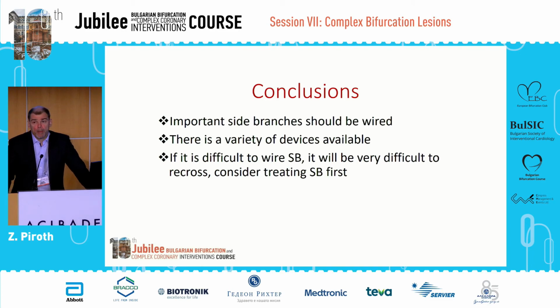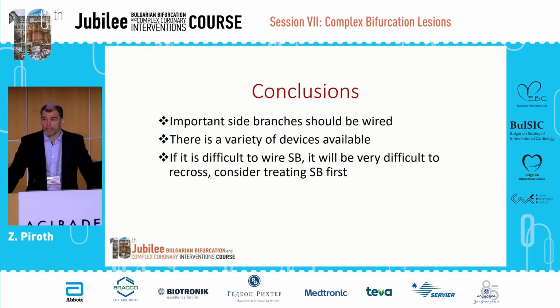So, ladies and gentlemen, in order to conclude, I would like to state that, of course, important side branches should be wired, and there is a variety of devices available for this. We should remember that if it's difficult to wire the side branch, it will be even more difficult to recross. So we should consider treating this side branch first. Thank you very much.